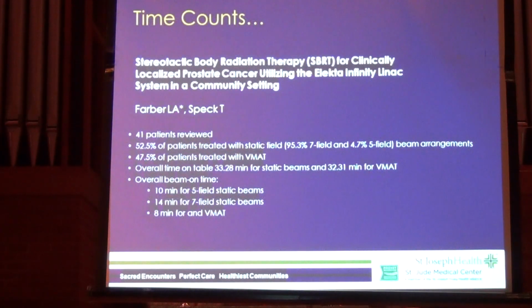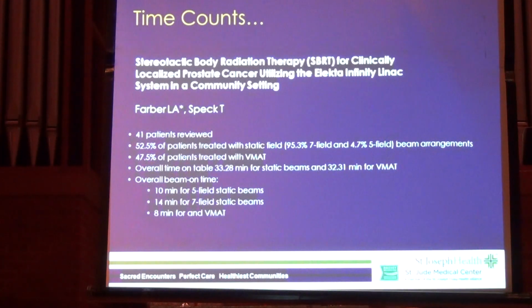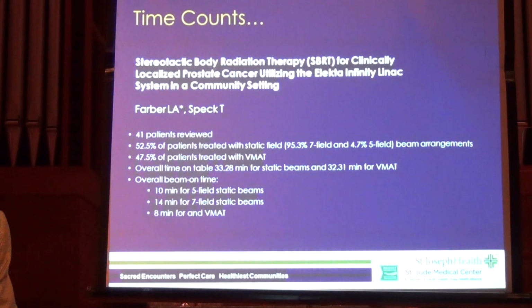This was a paper I had just put out when I was back in New York, where originally, if you hear of a CyberKnife treatment, for example, for radiosurgery, their treatment time takes 45 minutes to an hour. That's how long the beam is on and while the patient is being treated. With this technology that we've been doing, at the time that I put this together, it was 8 minutes for treatment, and now we're down to about 6 minutes of beam on time.